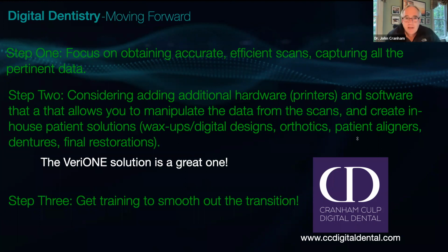And the labs can extract teeth and do a setup, get some photographs in there. And then the first thing you're printing is a prototype. You don't have like a wax try, and there's no wax rim or any of that stuff. It's just something that we put in and then take photos of and work from there. But I've had a ball with digital dentures the last 6 months. We've really implemented the workflows.